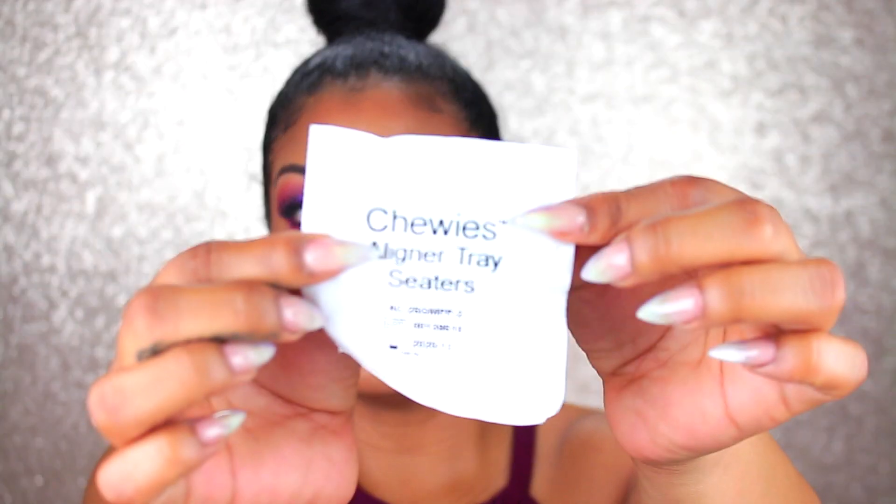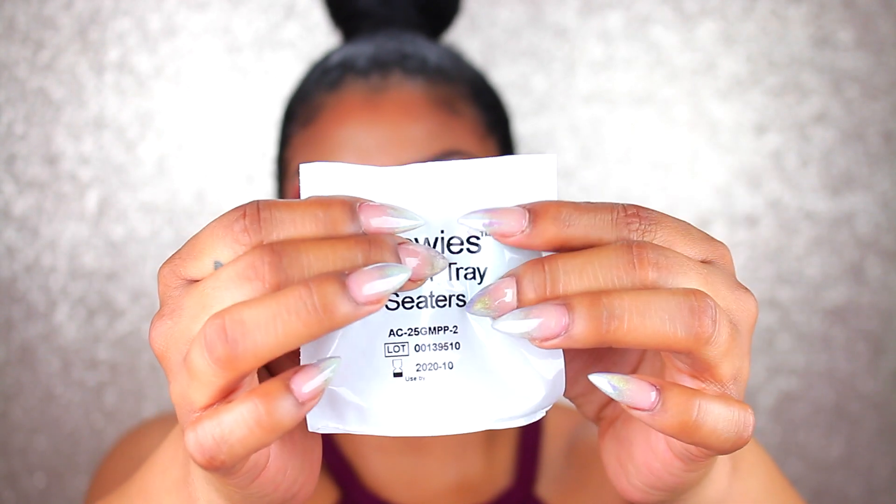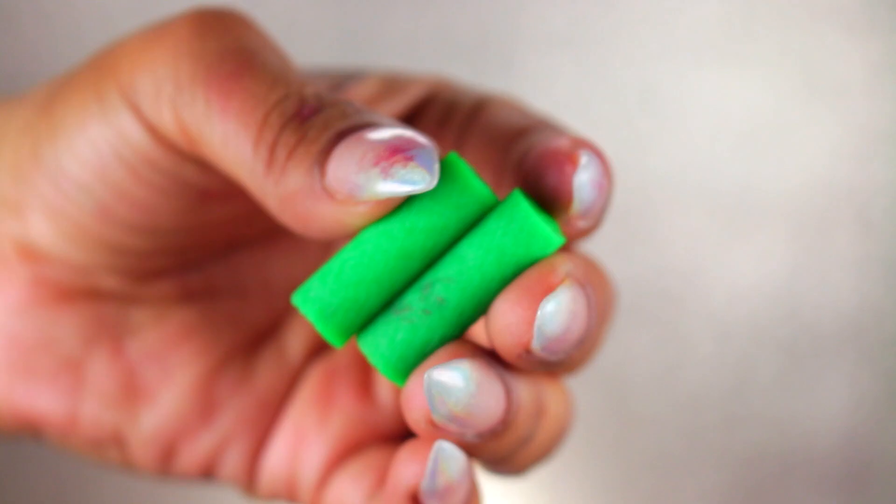They also included these aligner tray setters. They kind of remind me of earplugs but they're not — they're little green rubbery things. You're basically going to use these when you're applying your aligners, just to get them in there snugly. You bite on it afterwards and it'll make sure everything is seated properly, because you don't want to bite on the aligners directly without anything as you can crack them. Do be aware these are in here for a reason — if they're not completely clicking in, use these so you don't damage your aligners.